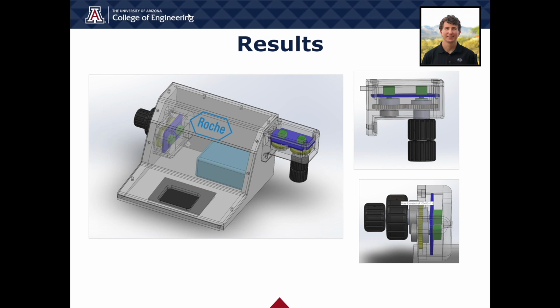The top case, once removed, allows for access to the majority of components inside of the system, with the exception of the gears, which have their own covers which can be removed by a couple of bolts.